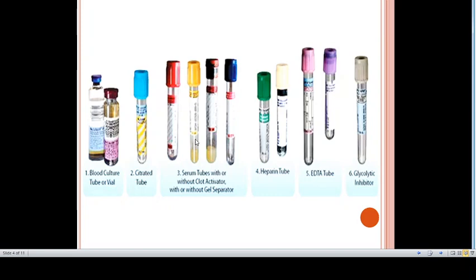These are the tubes that contain EDTA. While collecting blood, you should keep in mind the different types of tubes that you are using. These are tubes or vials that we use for blood culture. We have the citrate tube that is blue in color, and serum tubes with or without clot activator, with or without gel separator. We have heparin tube, EDTA tube, and glycolytic inhibitor tube.